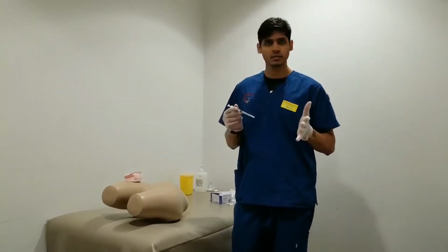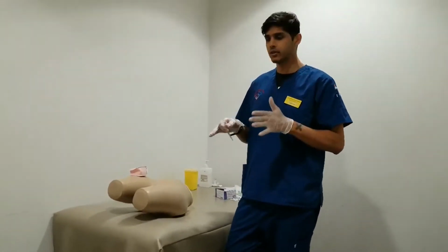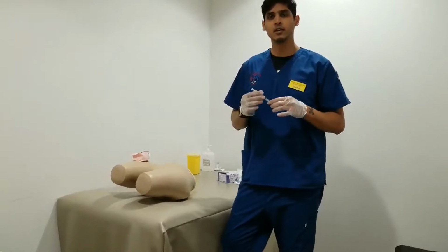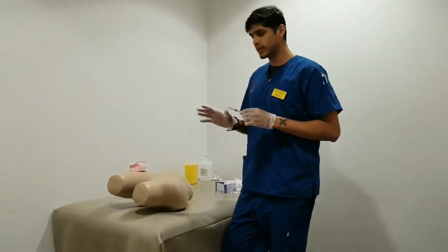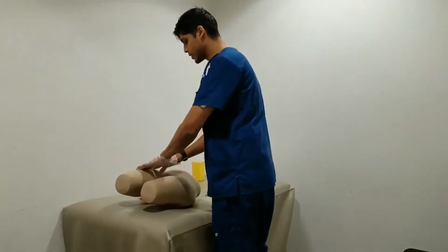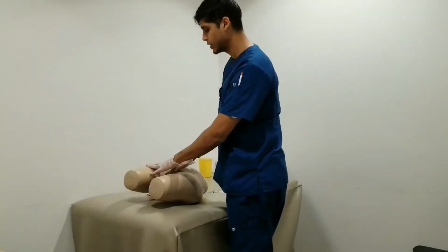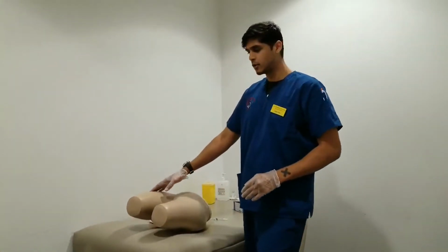Again, just like subcutaneous, we want to landmark and palpate the area to figure out if there's any lesions or any areas that we should avoid injecting into to prevent further complications. And once we find that area, which I'll walk through right now, through palpation, we're going to landmark the site. Again, right now I'm landmarking in the area of the vastus lateralis, which is one of the sites.